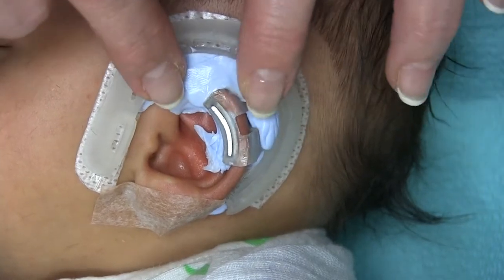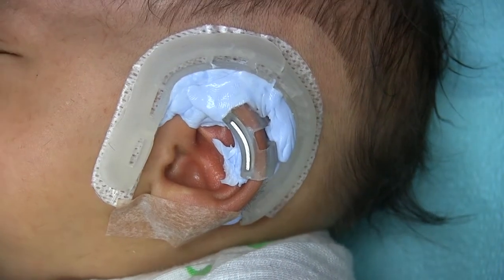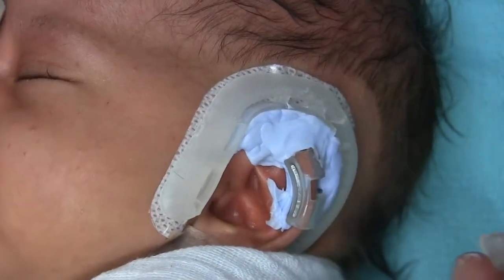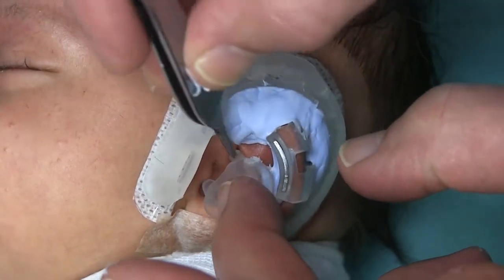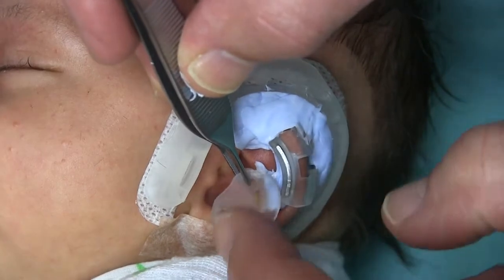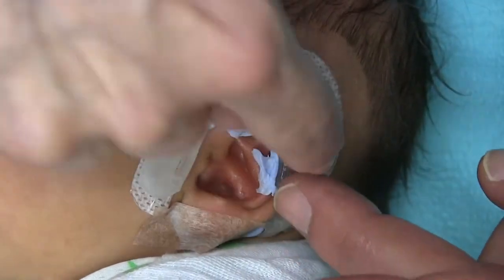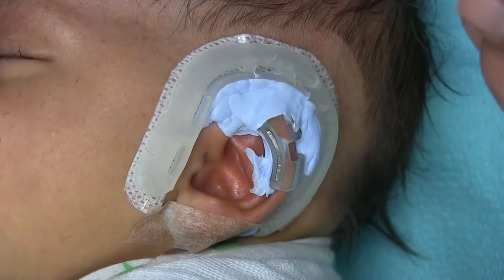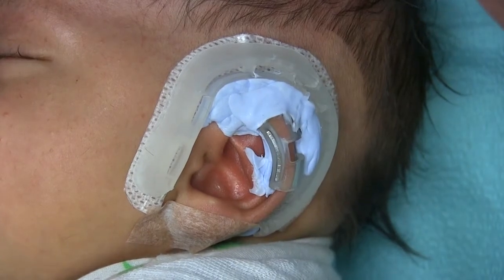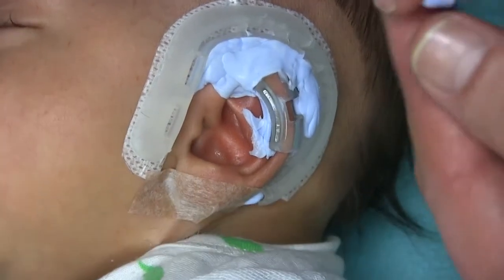Do you like that? Yeah. Okay. This didn't work. You got any more of this stuff? I don't know why it's not working. You're doing so good, we're almost done. It fits perfectly. I'll just hold that very gently in there. I've messed it up twice here — well, my third one's a good one. I want that to be perfectly smooth there and it's not.